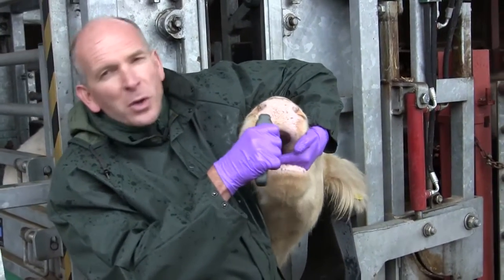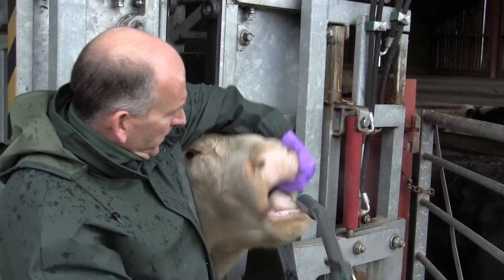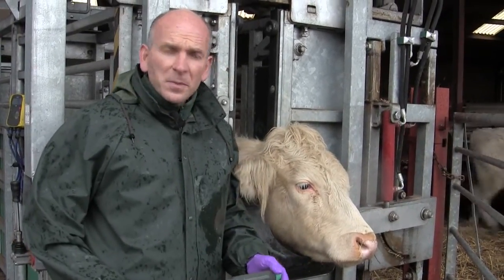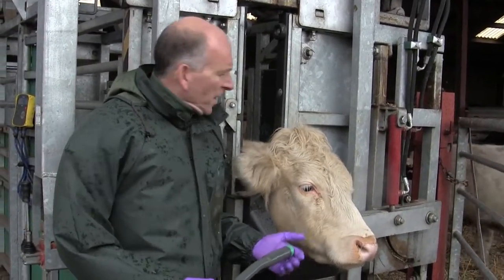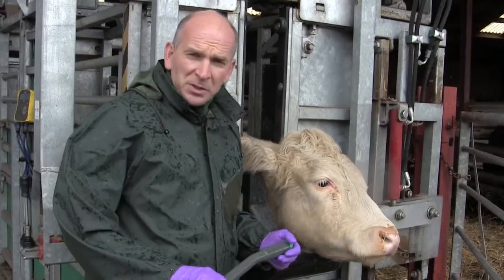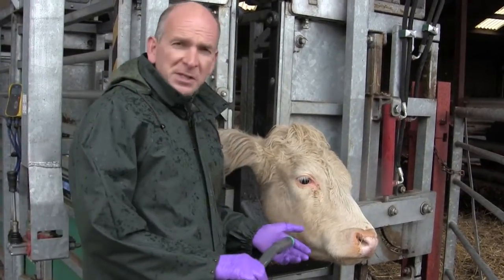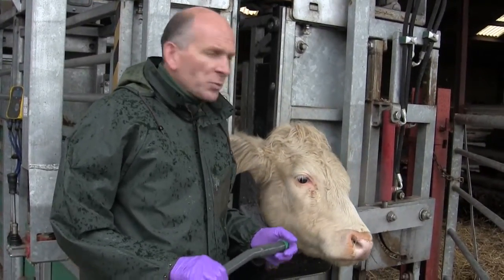The bolus will then be swallowed by the animal and the gun can be removed. It's important when giving a bolus that you don't use excessive force because you can damage the animal's throat. It's also important that the head and neck are held in a reasonably straight position so that the animal can swallow and the bolus can get from the back of the mouth to the rumen. If the animal is fighting you or the neck is twisted, it's very difficult to administer the wormer bolus properly and safely.